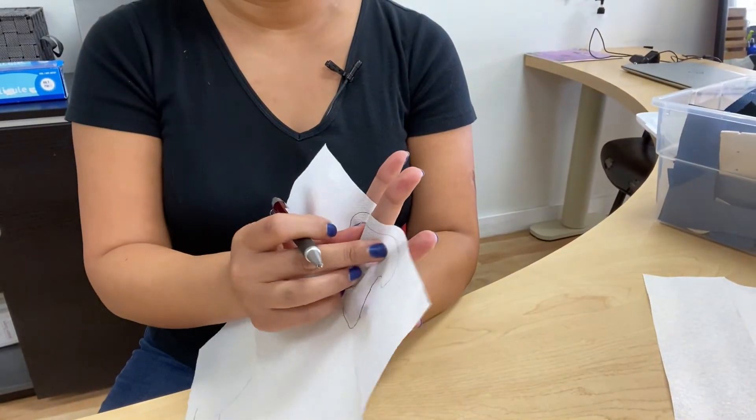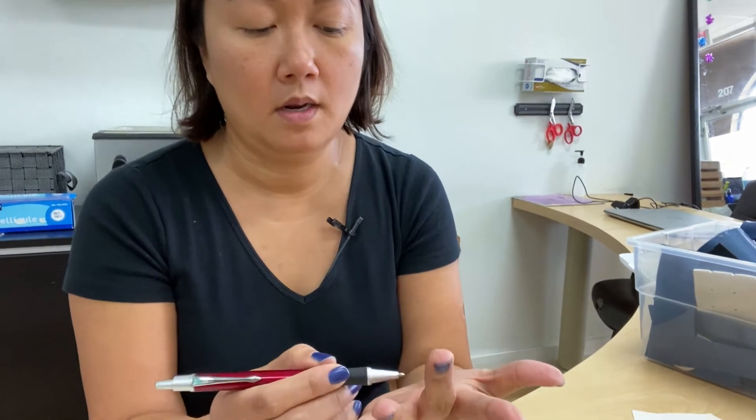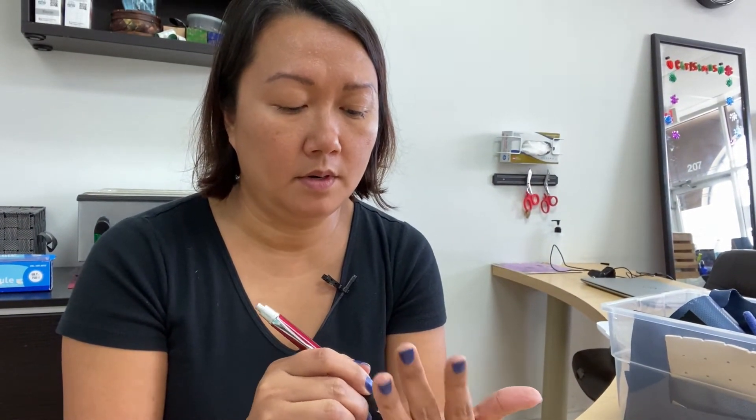All it does is it sits pretty much below the PIP and it comes down, comes like this and then comes like this to the other side. So in the back when I do it, it just touches — it comes together like this, but it doesn't overlap. If it overlaps, it can be a little bothersome or might pinch them. So I like to have it just touch. If there's a little space in between, that's okay. But if the gap is really huge, then it might not fit nice and snug.